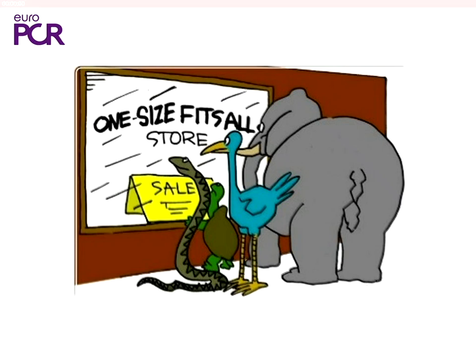But having a double layer of stents and clot probably increases the risk of thrombosis. And you know, the decision was easy because the patient decided for us. We don't have a small graft master. We have an acute coronary syndrome, TIMI 1 flow, so you have to do something. And the decision was easy at that moment.